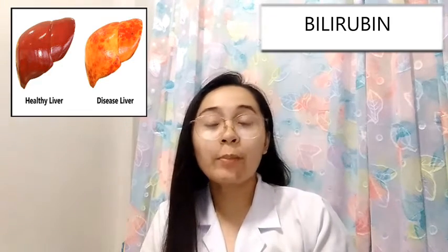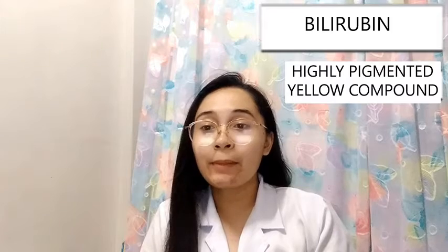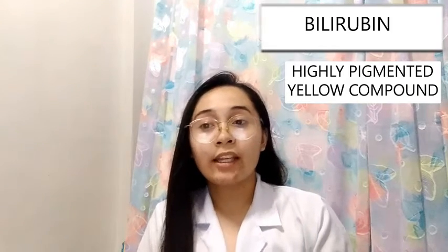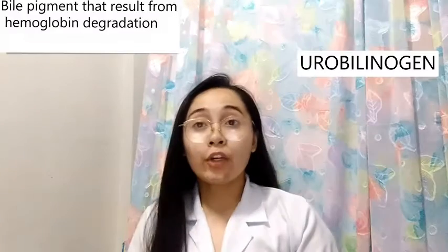Bilirubin. The appearance of bilirubin in urine can provide an early indication of liver disease. It is often detected long before the development of jaundice. Bilirubin is a highly pigmented yellow compound. It's a degradation product of hemoglobin. So the physical indication in urine is an amber color with yellow foam.